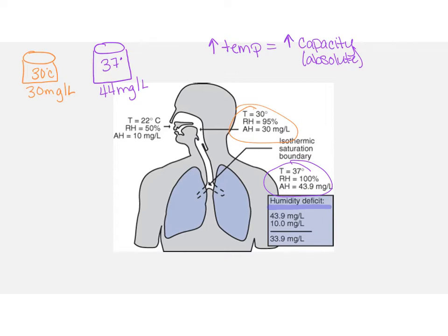Number 2, what could cause the ISB to shift up? We know that shifting distally is going to be caused by things that decrease the gas or eliminate the gas from being in contact with the upper airway. So if the ISB is shifting up, it's going to be an opposite problem.